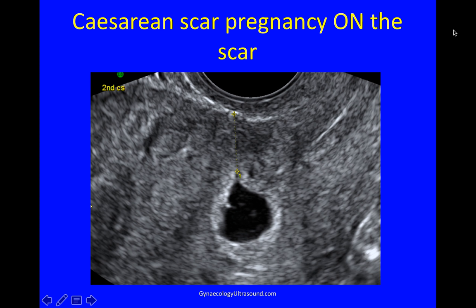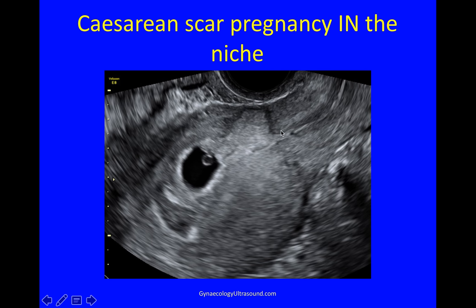Here is what that looks like. Again it's an anteverted uterus, with the region of the internal os and an empty cervical canal. You can see the triangular gestational sac and a quite thick, well-healed section scar — so this pregnancy is implanted on top of the scar. Whereas in this other image you can see the caesarean section scar has become a cup-shaped niche, it's very deficient, and the trophoblast has embedded within it — all of this is trophoblast, and you can just still see that slight triangle. These pregnancies, if they continue into the second and third trimester, will develop into a morbidly adherent placenta.